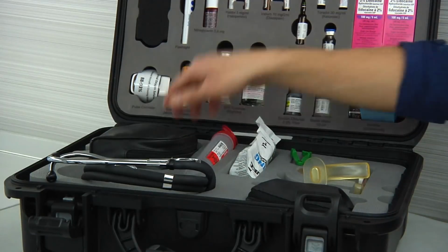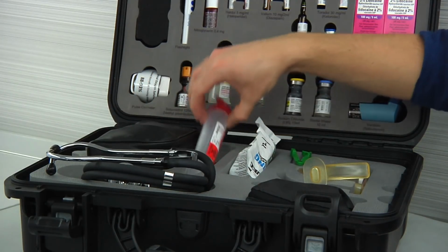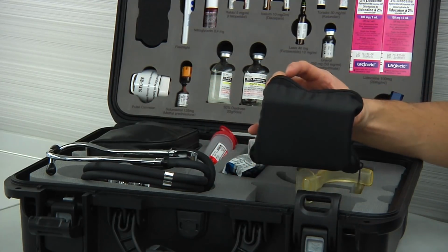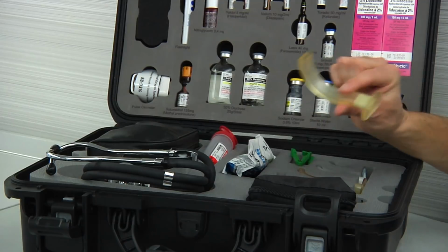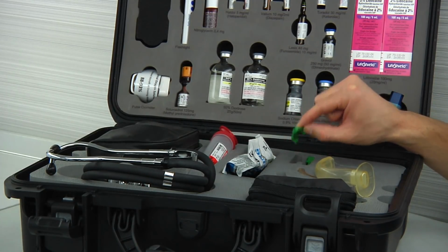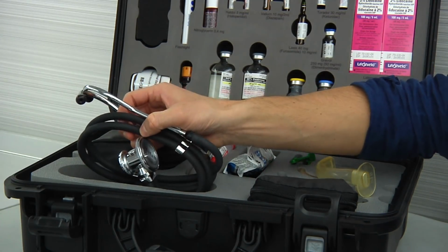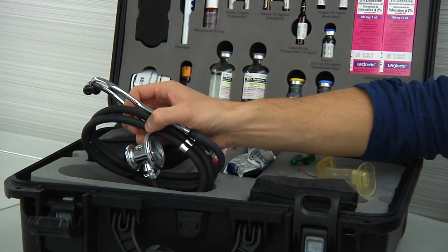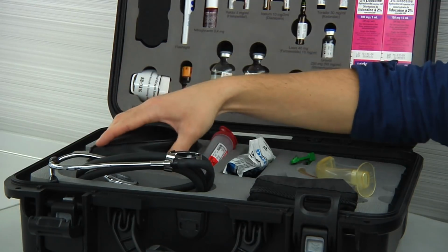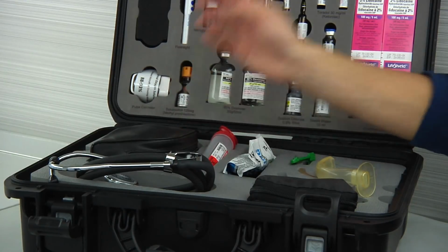So we'll talk a little bit about the equipment now, which is located starting on the bottom tray. You'll notice that there's a blood pressure cuff, a stethoscope, a sharps container, a burn dressing, a glucometer. There are various sized oropharyngeal airways, and even umbilical cord clamps. Something to note, at altitude, it is very difficult to hear breath sounds and to estimate blood pressure with the stethoscope. You may find it helpful when using the blood pressure cuff to estimate the systolic blood pressure, either using the radial pulse or the pulse oximeter.